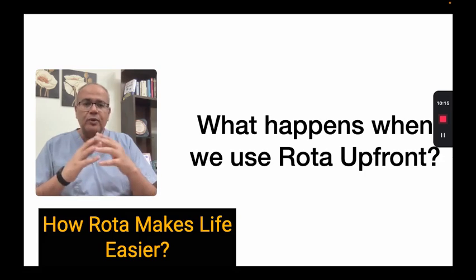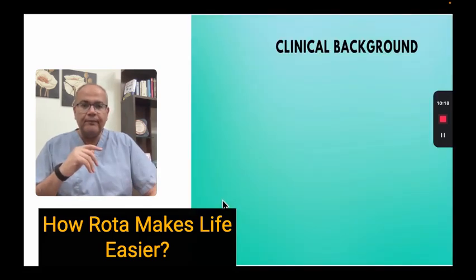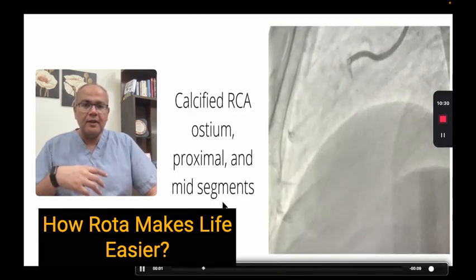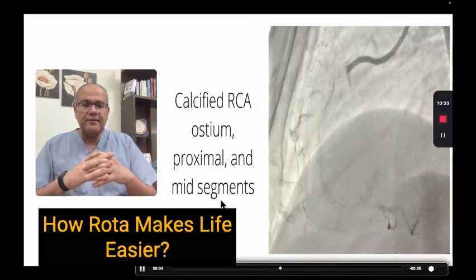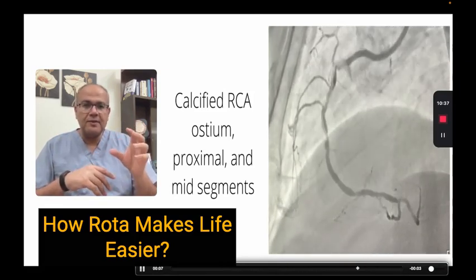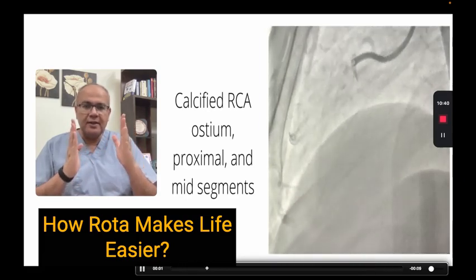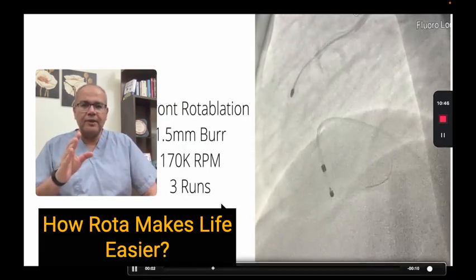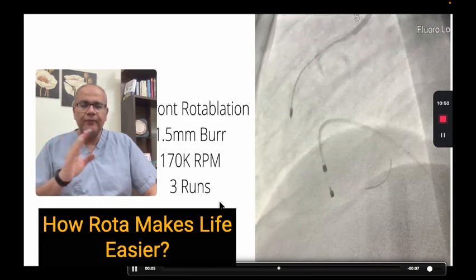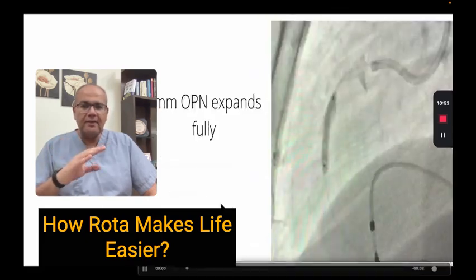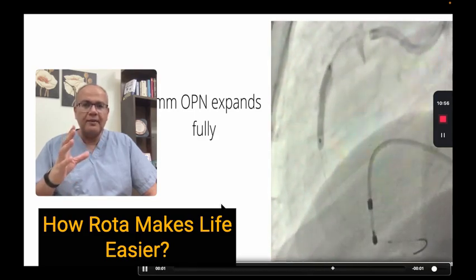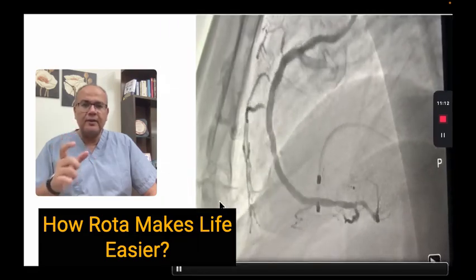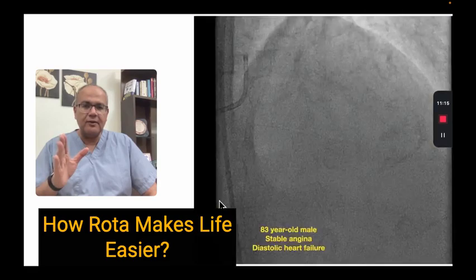So we've seen what happens when we ignore proper vessel preparation — catastrophes can happen. What happens when we use upfront rotational atherectomy? This is a 59-year-old gentleman with recurrent acute coronary syndromes. We can see why: dense calcification in the ostium of the right coronary artery, the proximal RCA, and the mid RCA. Seeing a long segment of fluoroscopic calcium, we don't waste time with balloons. We go directly with rotational atherectomy upfront — 1.5 mm burr, three runs, we ablate the lesion. We confirm success by fully expanding a 3 mm balloon at the lesion and ostium of the RCA. The stent was deployed, the vessel was optimized, and the final result was great.